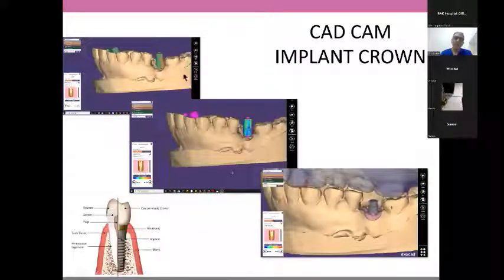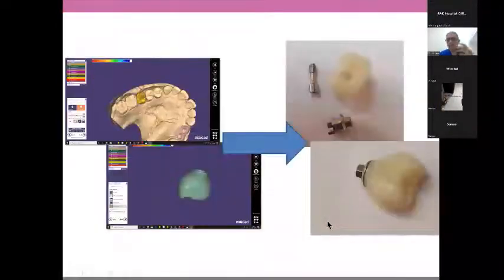So we have very accurate techniques of recording the position of the implant. Then we design it, then again CAD/CAM mill it. So it fits very beautifully over these implants. The fitting, as I told you, is all about biology and mechanics, so nuts and bolts. So fitting is a very, very important part of it.